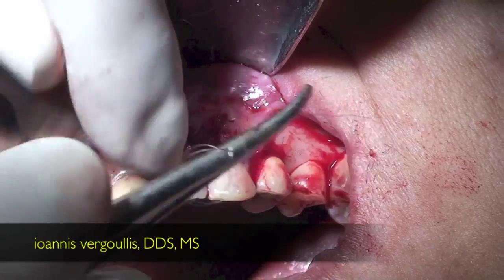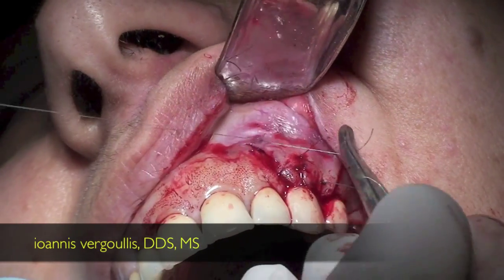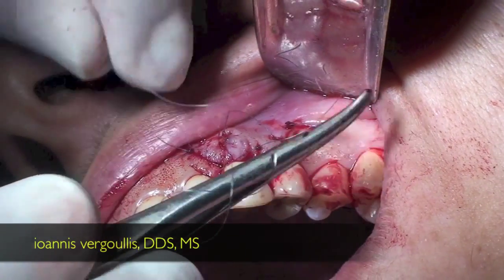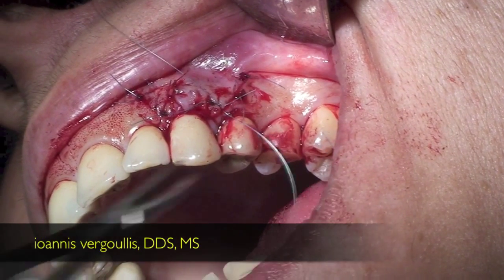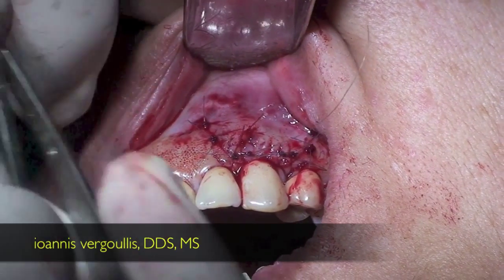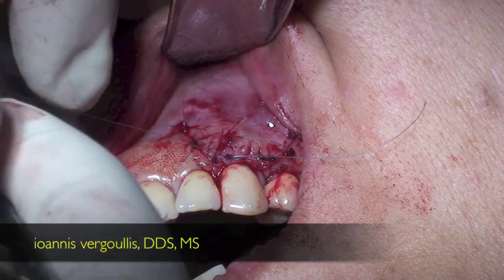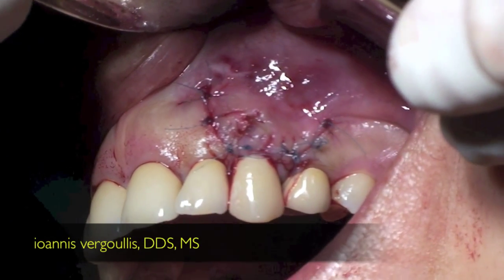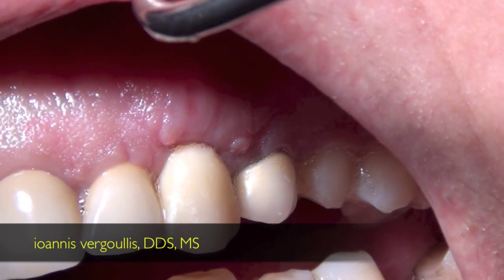It is very important not to have any tension while you are coronally positioning your flap. Finally, we suture the vertical incisions in an oblique manner in order to allow for coronal adaptation of the flap. At the end, we put some interrupted sutures in order to further stabilize the graft around the margin of the temporary crown. And you can see here that upon lip movement, we don't have any pressure in the area.